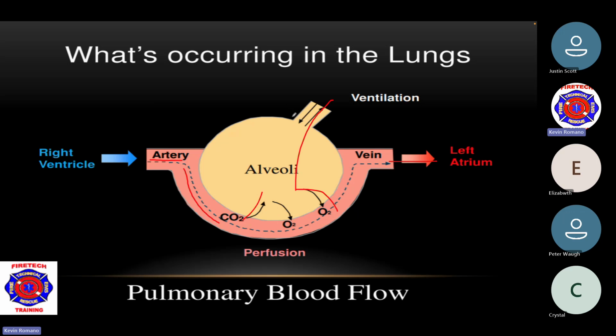Another point of interest is that our end-tidal carbon dioxide is measured in the alveoli. Once you leave the alveoli, headed back out all the way to the oropharynx and nasopharynx, to the nose and the mouth, that is all considered dead space. From the alveoli up is all dead space that we need to consider. We'll talk about dead space and rebreathing later on, and we'll look at the different capnography waveforms for that.